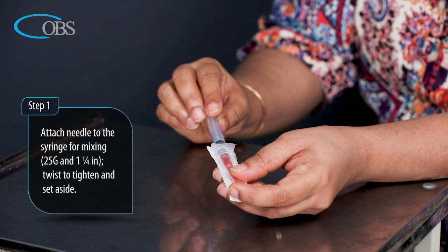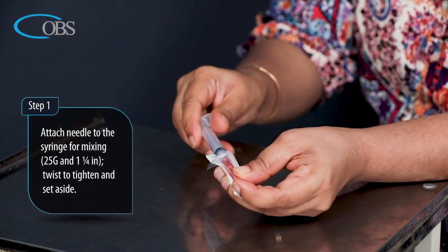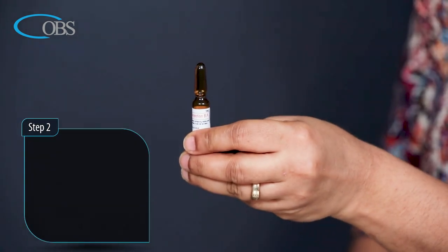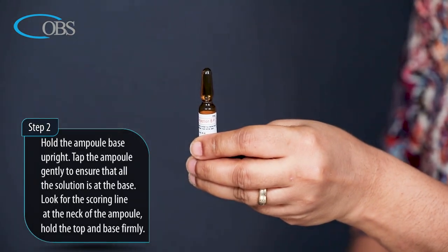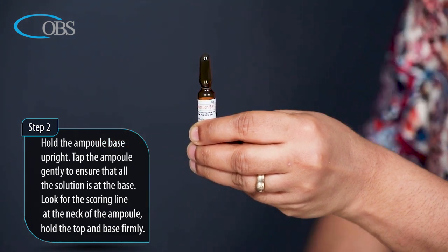Step 1: Attach the needle to the syringe for mixing — 25 gauge thickness and 1 and 1/4 inches length. Twist to tighten and set aside. Step 2: Hold the ampoule base upright and tap the ampoule gently to ensure that all the solution is at the base.